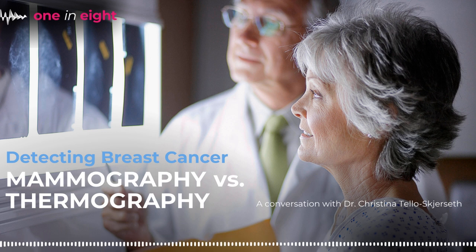And I'm not familiar with thermography in this space, especially when it comes to screening for breast cancer. Can we start by having you break down the differences between mammography and thermography? Sure. So mammography is essentially obtaining a specialized x-ray of the breast where you can see the different kinds of tissues in the breast. And the purpose of that is to find breast cancers when they're smaller and earlier and better to treat.